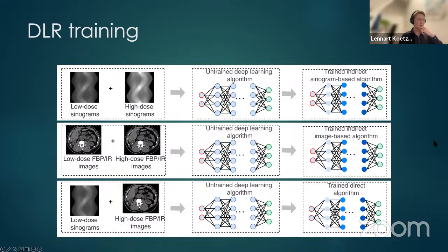It's also important to note that when the network is employed in the clinical setting, the training process is stopped. So it doesn't train anymore on the patients it sees in the clinical setting.